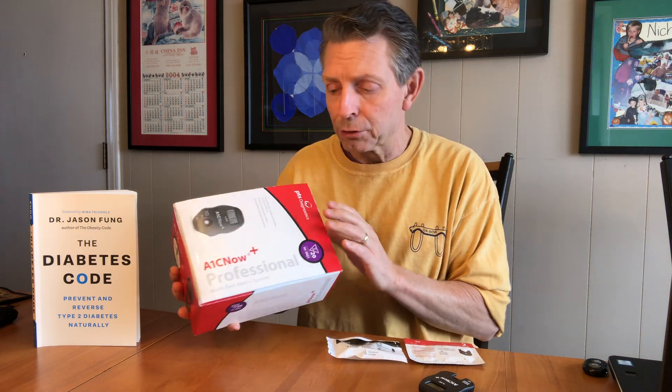You can buy this A1C professional kit in the United States. It's about $140. There are 20 samples in here.